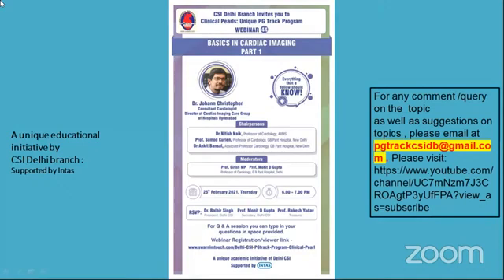The similar thing in amyloidosis: if you find a restrictive physiology in a patient, and you have a very high ECV and a high T1, you don't need to do a biopsy of the septum to prove it's amyloidosis. It's there and standing in front of you. And these patients can be treated literally without doing a biopsy.